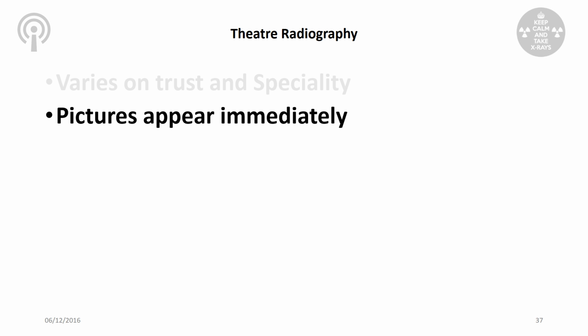Maybe if we did it like a theatre production, it might be a little bit more interesting, so we could find out. But theatre radiography varies on trust and speciality of the hospital that you work at. Some hospitals, like major trauma centres, primary trauma centres, will pretty much do anything and everything in theatre. The pictures appear immediately, and we can do moving images.